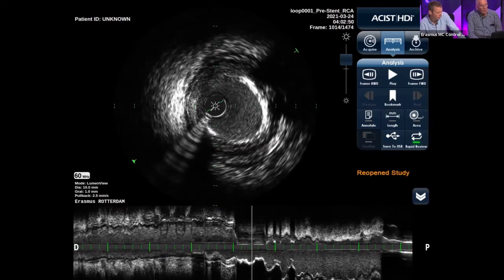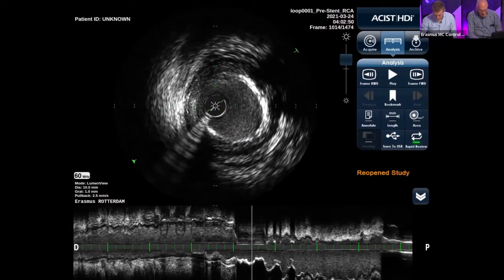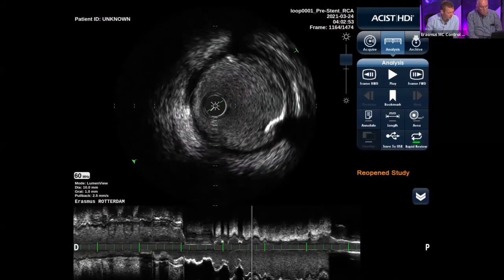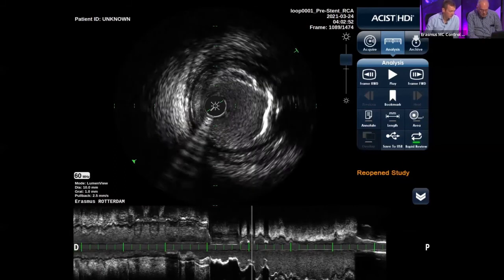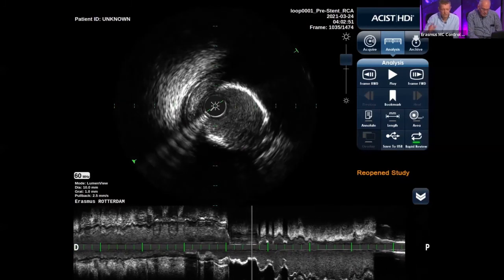But we also know that 30–40% of the thrombi in patients with STEMI arise from calcific plaques or even nodular calcifications that might disrupt the flow and are in some way thrombogenic. So the operator here actually proceeded. The good thing about the calcium is that there is no concentric calcium, which would be a sign of very severe calcification, and there are no signs of 270 degrees or more of calcium. Virtually everywhere you see disruptions in the calcifications.